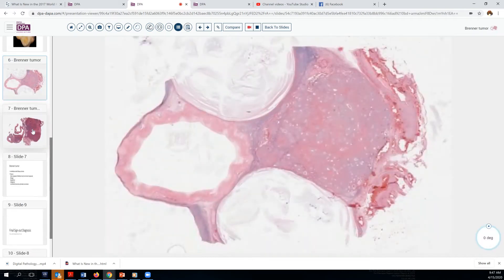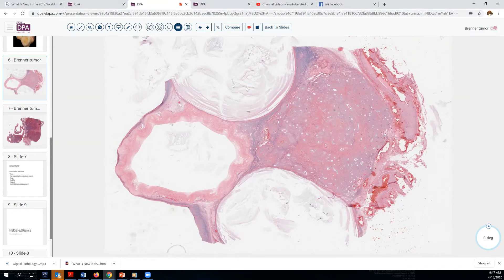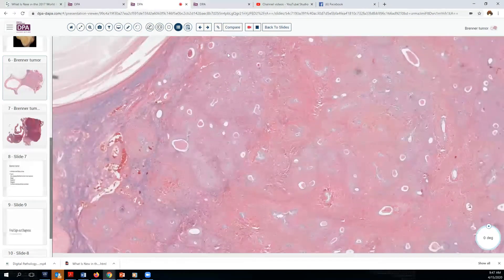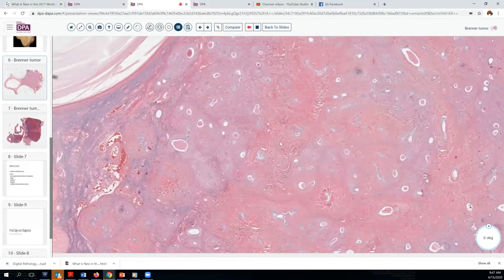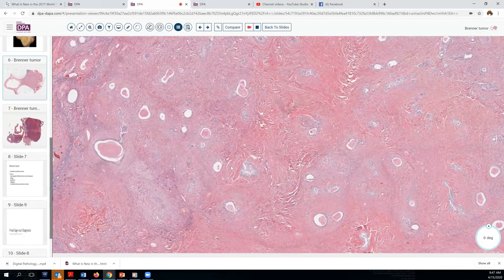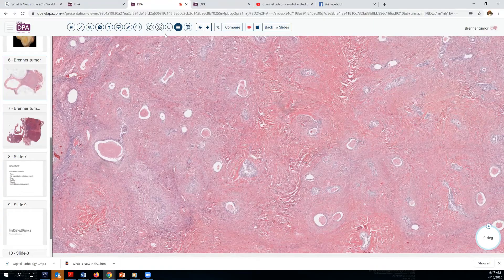These lesions can have other cystic components. Here's a section of a tumor that has what looks like three large cystic spaces, and right here is our Brenner tumor with transitional epithelium. As you can see, we have many cystic areas, a fibro-thecomatous stroma, and some solid nests.